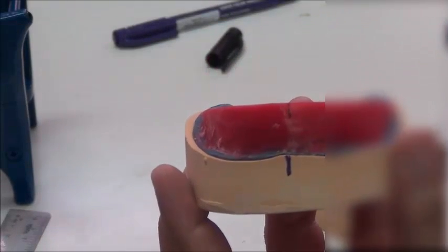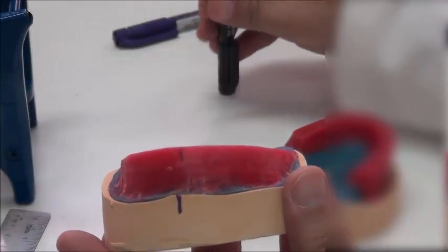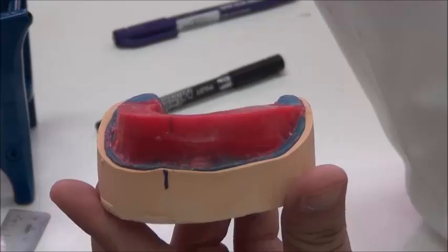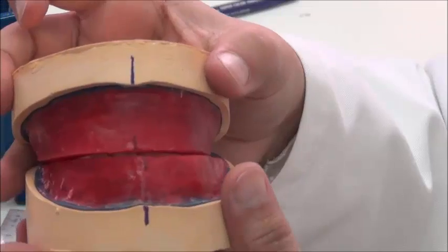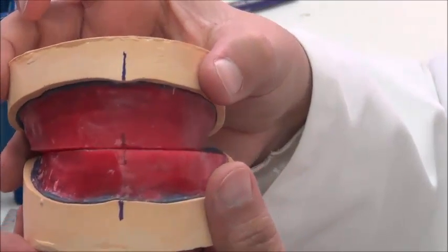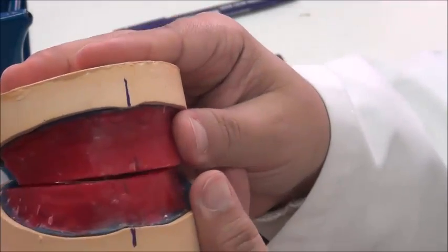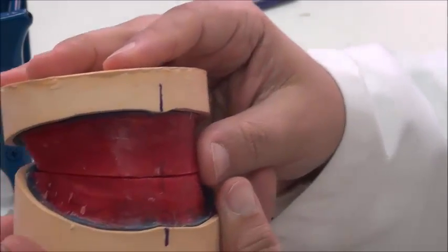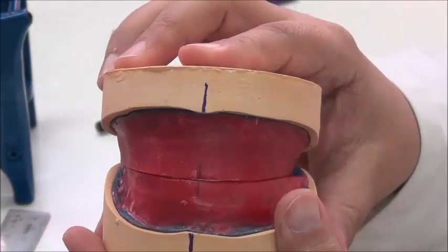So the two midlines are now coinciding. And also when I want to mount, so this cast is now ready with the base plate on it, and I want to mount it all over the other upper cast, which is already inside the articulator. I put them out of the articulator just to show you how I need to make sure that the midlines come inside. So I would go to the left and right until the midlines of the wax, the casts are coinciding and are all over one line.